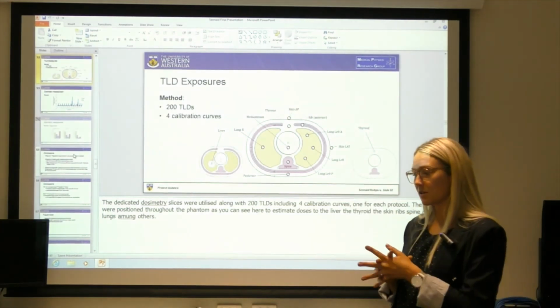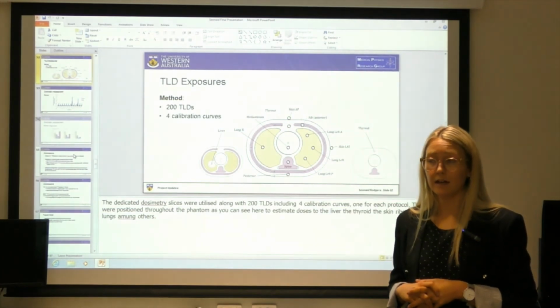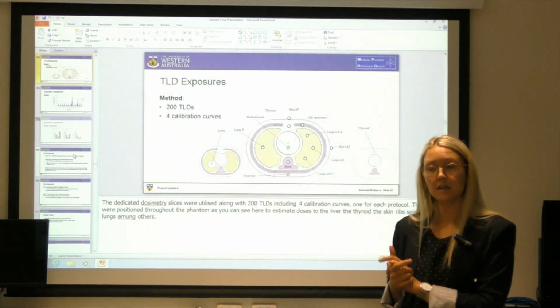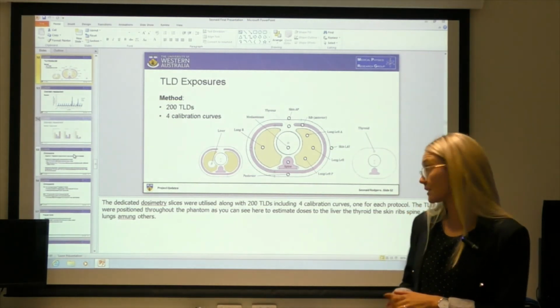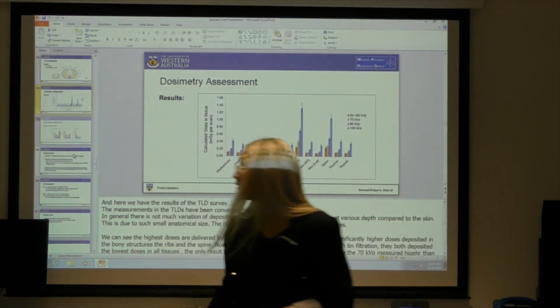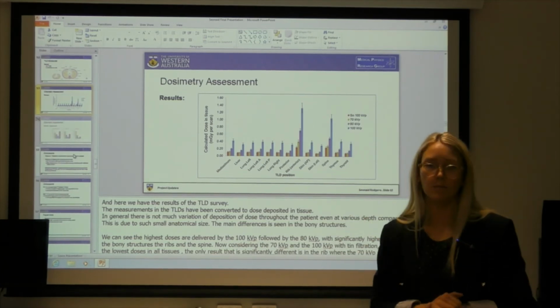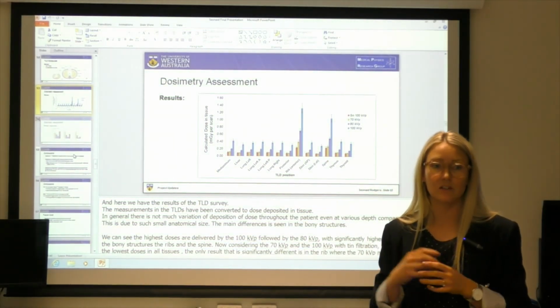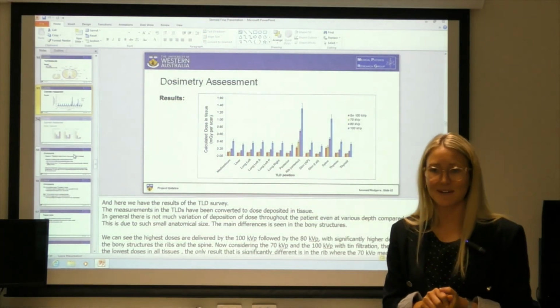The uncertainty mainly came from the calibration curve, from the calibration TLDs, rather than the positioning or changing the TLDs, and that was about 10%. The relative uncertainty was indicated as the bars on the graph, but this was corrected per scan. So I did 20 runs to reduce that uncertainty. The bars are corrected for just 1 run. That's the relative uncertainty indicated on the bars. Thank you.